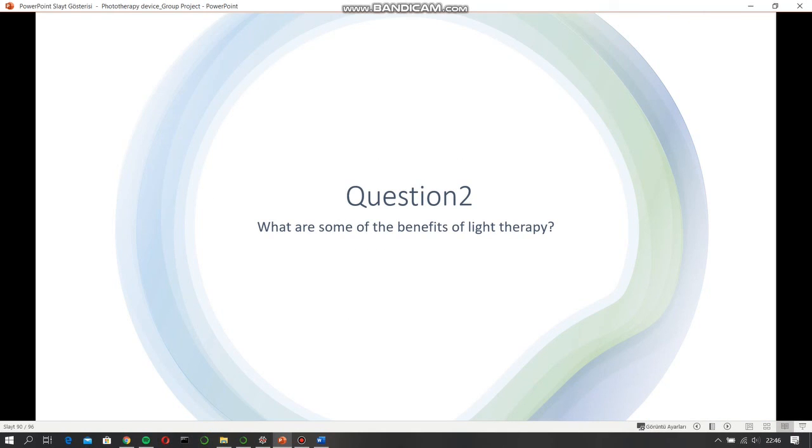And the second question: what are some benefits of light therapy? Actually, it's a really important question, and we can say phototherapy or light therapy increases the healing response, tissue repair, decreases the inflammation, pain, edema, or increases the nerve function, pain relief. Also, it increases the immune function and increases the local blood flow via vasodilation.